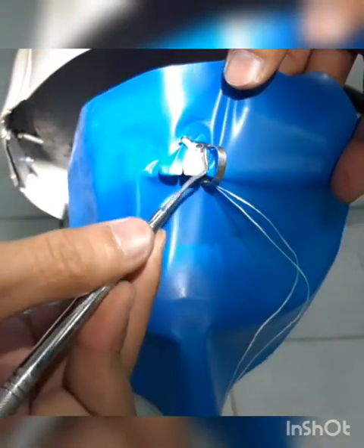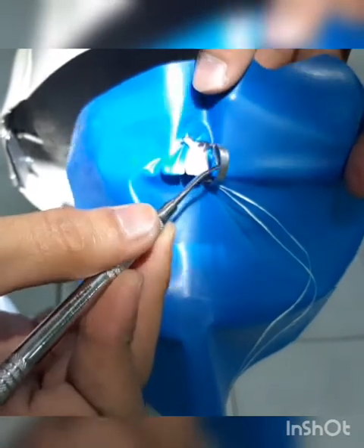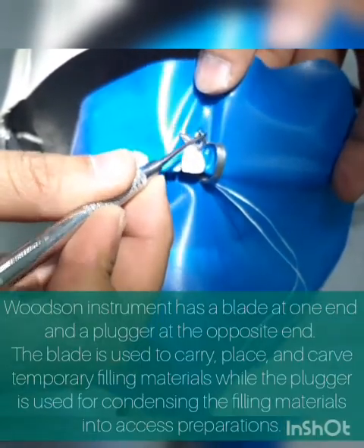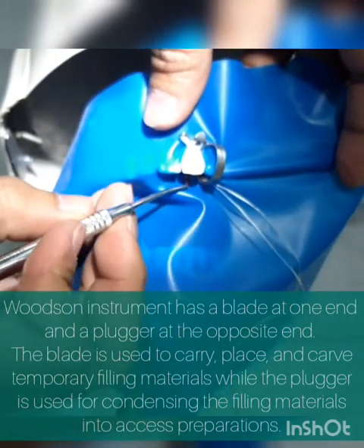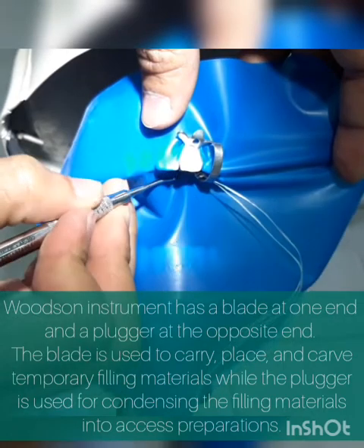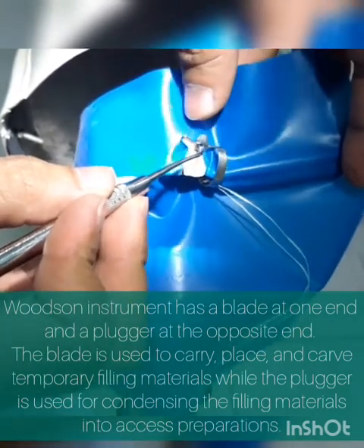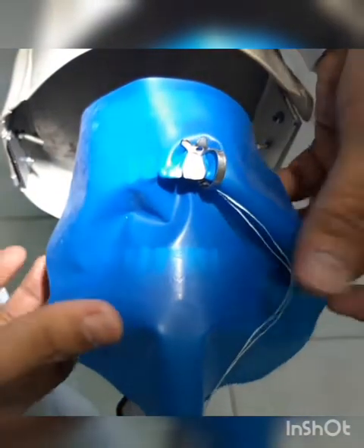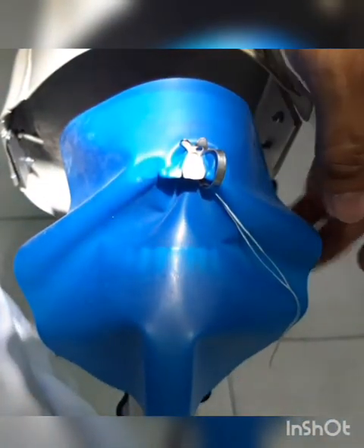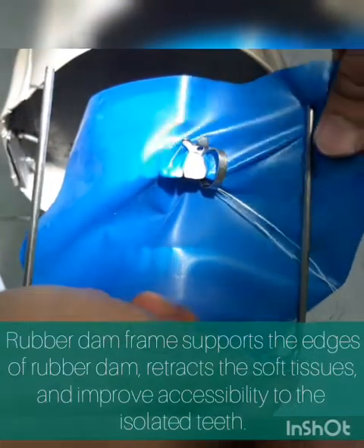You need to untuck the rubber dam sheet from the central wing using your Woodson instrument, and also on the lingual. This is to prevent saliva from coming in through the perforation or the hole. That's how you place your rubber dam sheet, and then place the rubber dam frame to secure the assembly.